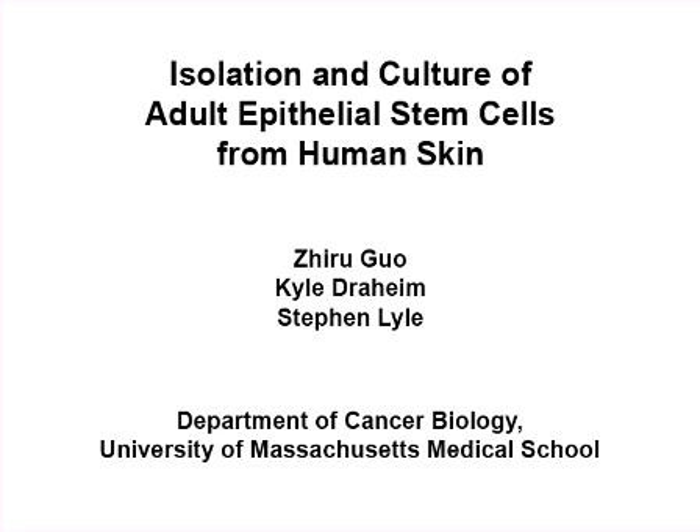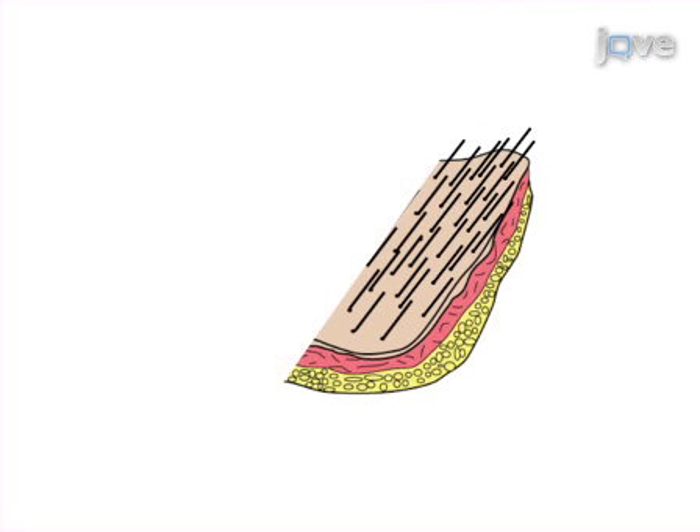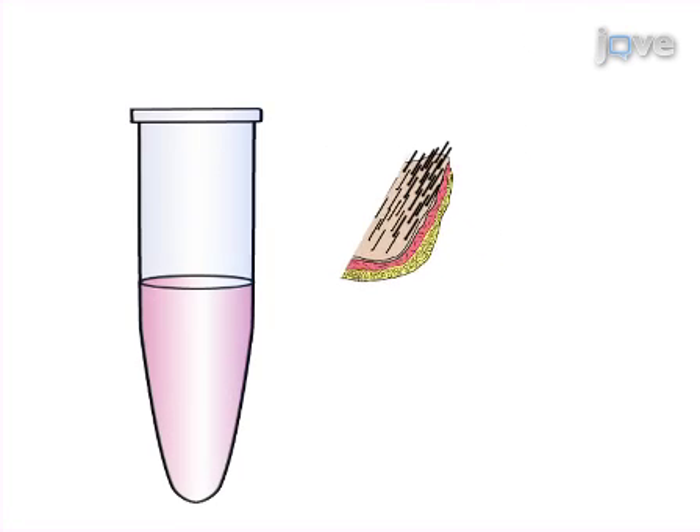The overall goal of this procedure is to isolate and culture adult epithelial stem cells from human skin. This is accomplished by first cutting fresh human skin from facelift or other surgery into one centimeter wide strips and incubating in media containing dispase.